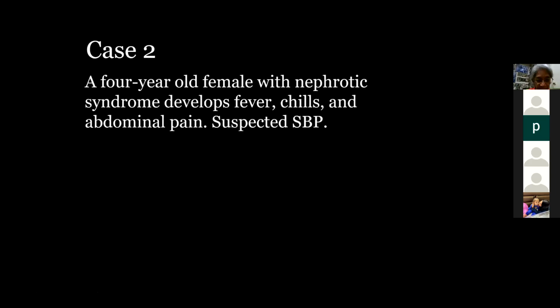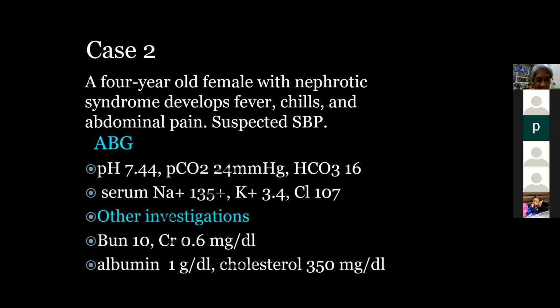And because of the nephrotic syndrome, and because of the respiration pattern, he can be having respiratory alkalosis also. Yeah, so very good. Because of the pain, the abdominal distension, etc., you can have a respiratory alkalosis or a metabolic acidosis. So now this is the ABG which we have of this child, and we also added other investigations which we've done in this child. So you can take a few minutes to analyze it and give your answer.